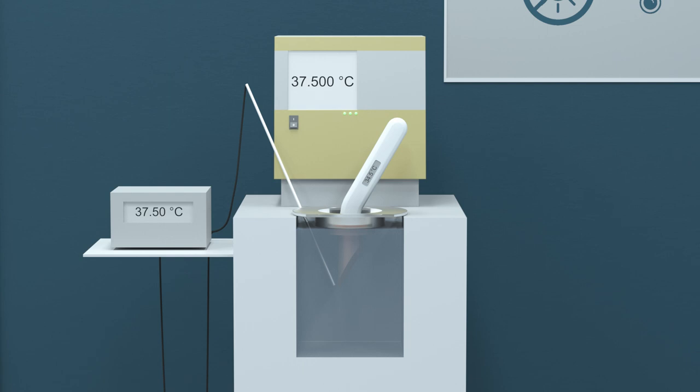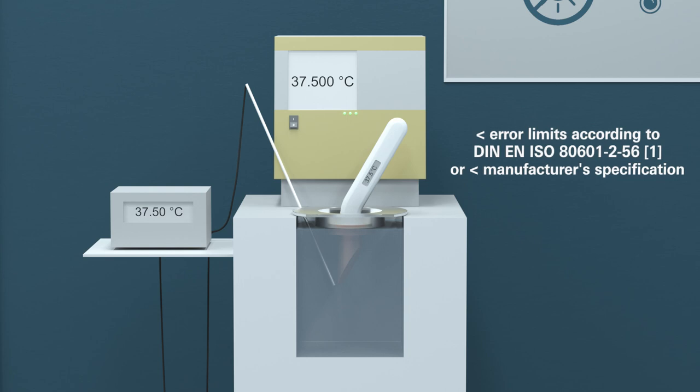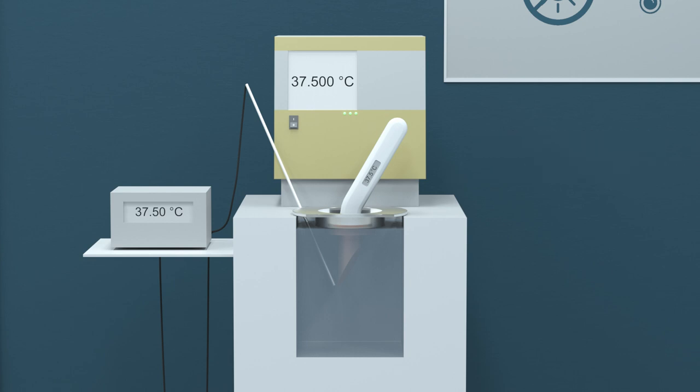Compare the temperature indicated by the ear thermometer with the temperature of the reference cavity radiator. The difference between the indicated and the reference temperatures must be within the error limits prescribed by DIN EN ISO 80601 Part 2-56 or the manufacturer's specification. If this is the case, you can trust the ear thermometer to deliver reliable and accurate measurement results.